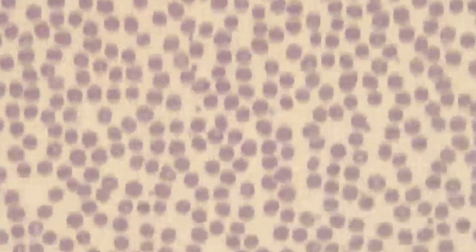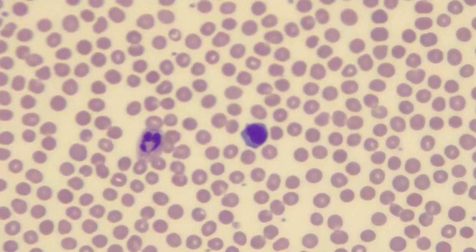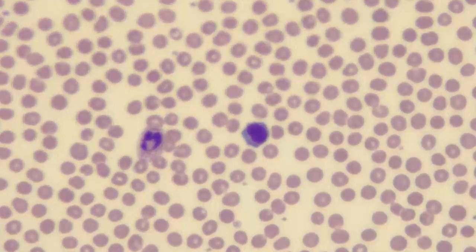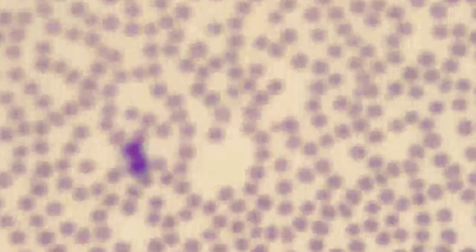Okay, so here we have a small lymphocyte. As you recall, there are two types of normal lymphocytes. We have the small, like this one, that might be around the size of a neutrophil. It tends to be kind of roundish, and the nucleus also tends to be round and take up most of the inside of the cell itself, and the cytoplasm tends to be kind of darkish blue or purplish, and I would say that looks like the staining is correct on that one.